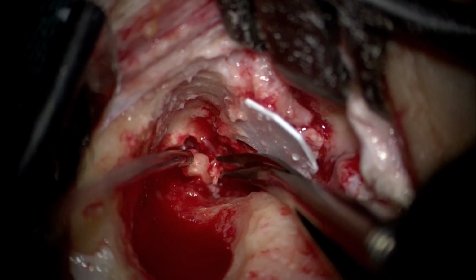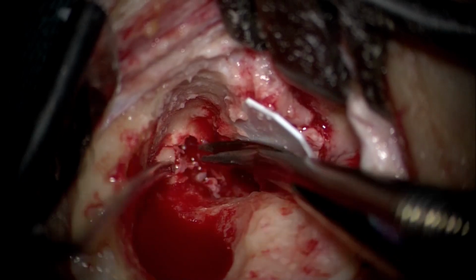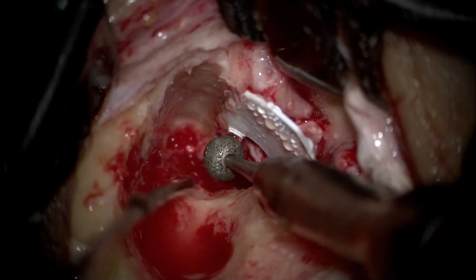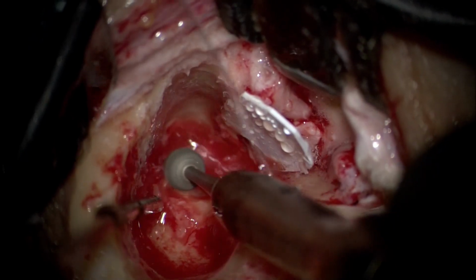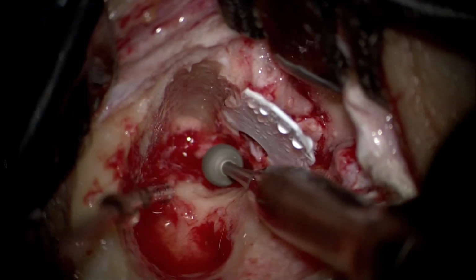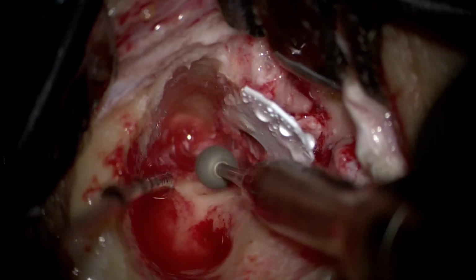So we are clearing off now the malleus head, the remnant of it. You can see it's already eroded. The incus was already removed. Now here, side by side, we start doing the lowering of the facial ridge as we saucerize this cavity. And apart from lowering, what we also strongly recommend is the thinning of the facial ridge.